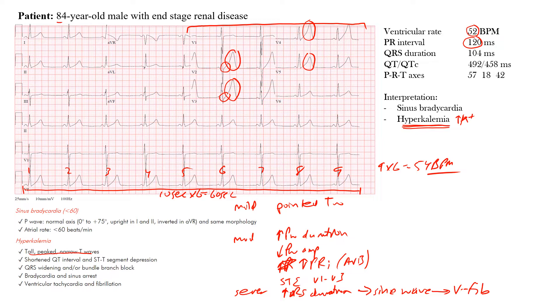Normal PR interval is 120 to 200 milliseconds in adult patients, so 120 is within normal limits. As the potassium level gets greater we may see an increase in that PR interval, but we're not there yet. This is likely an early sign of mild hyperkalemia. The QRS duration is 104 milliseconds, also within normal limits — in severe cases the QRS duration increases, but we don't see that here.